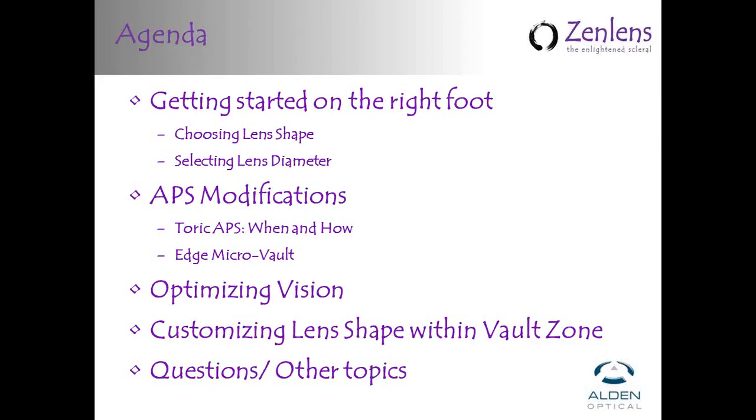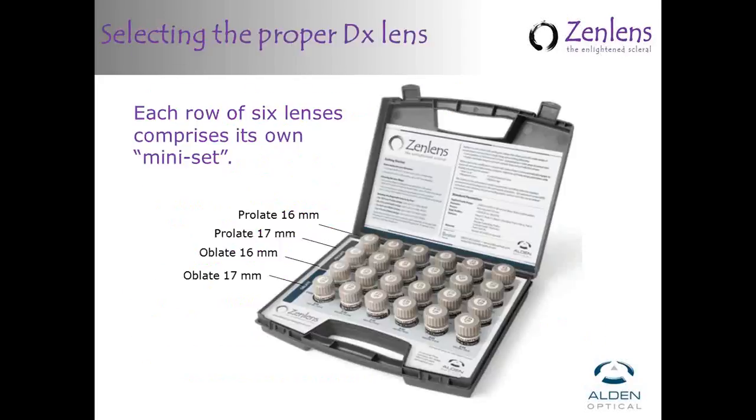So at this point, I'd like to turn it over to Dr. Jason Jedlicka, and he's going to do a quick review on the components of the diagnostic set and the means to select the proper diagnostic lens to get you started on the right foot. Jason, want to take over here? Sure. Thanks, John. It's great to be here with everybody today.